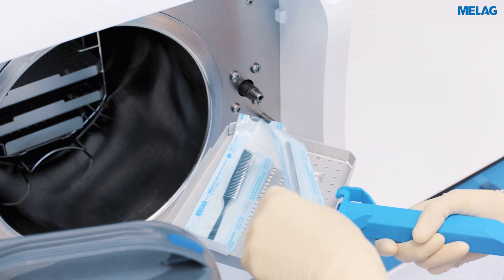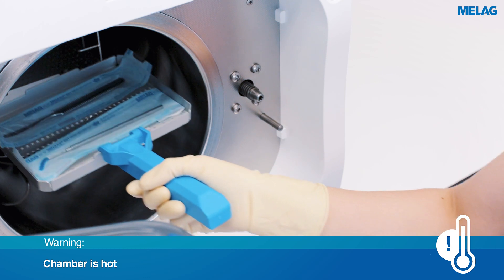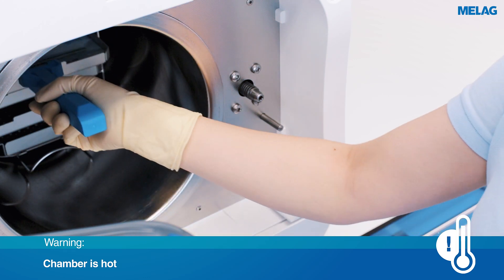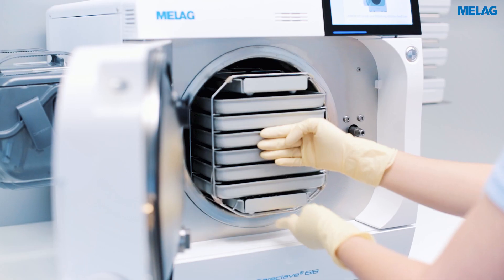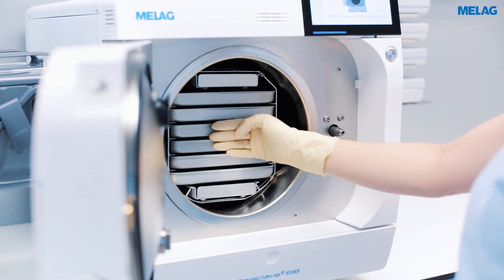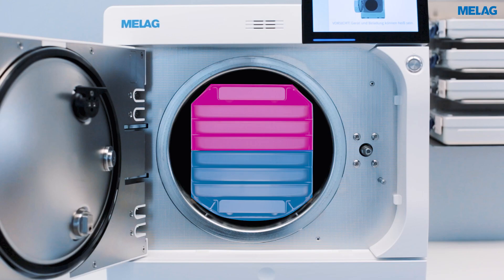When loading the trays, please ensure that several instruments are not lying flat on top of each other and that the paper side of the foil wrapping is facing downwards. Benefit from our large selection of different mounts when sterilising larger quantities of instruments. Please observe the following loading instructions for optimal drying results.